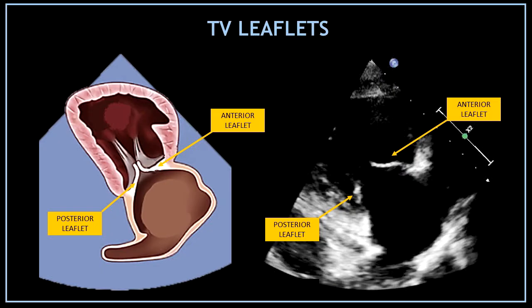In the middle of the view between those two chambers we can find the tricuspid valve. In this view we can visualize two different tricuspid valve leaflets. On the right hand side you can visualize the anterior leaflet of the tricuspid valve, and on the left hand side you can see the posterior leaflet of the tricuspid valve.